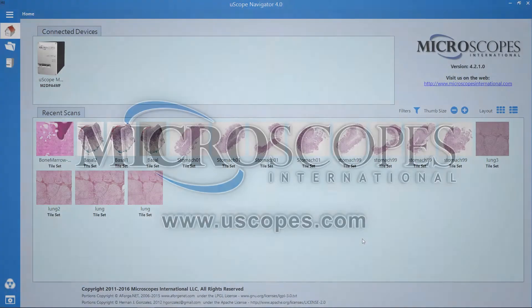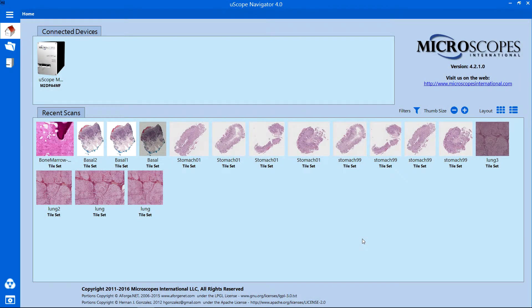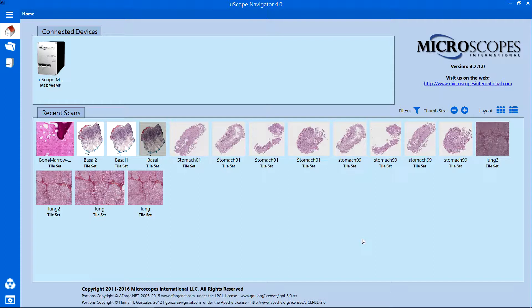Uscope Navigator is the Windows application that allows you to control the Uscope digital microscope, scan slides, and manage your images.